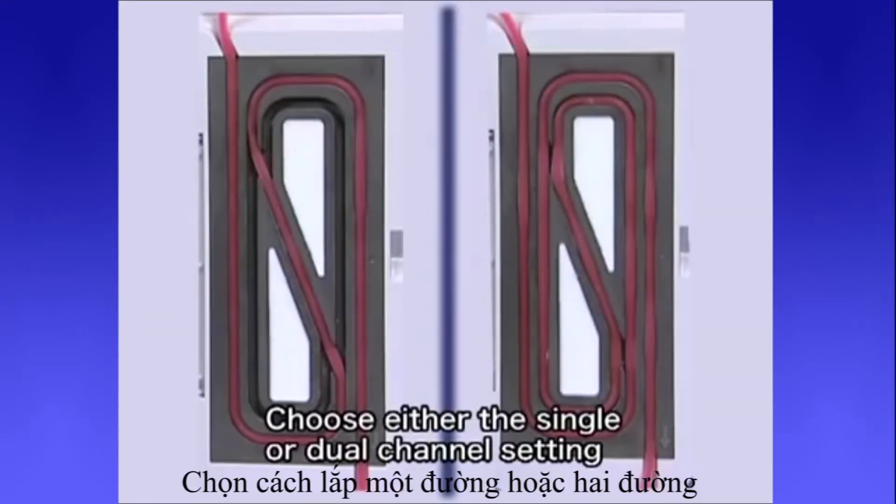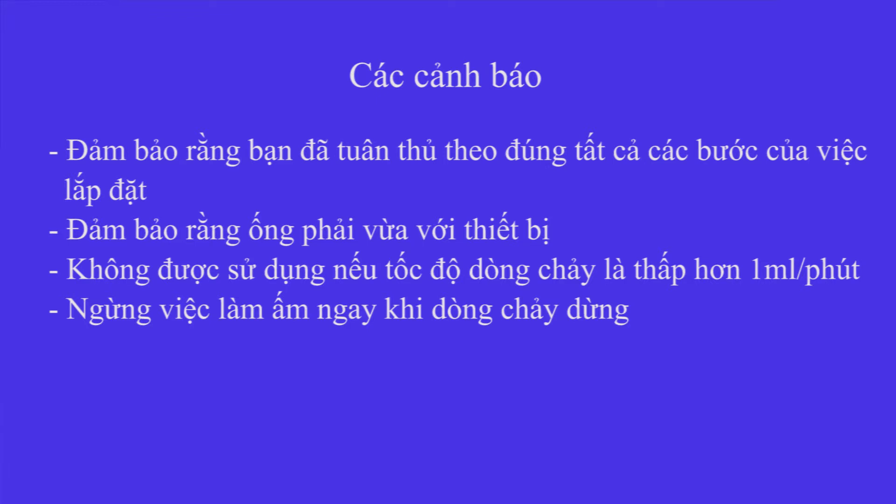Choose either the single or dual channel setting. Be careful to follow all steps when using the device. Verify the tube size fits. Do not use the device once the rate of flow has dropped below 1 milliliter per minute. Stop warming once the flow of fluid has stopped.